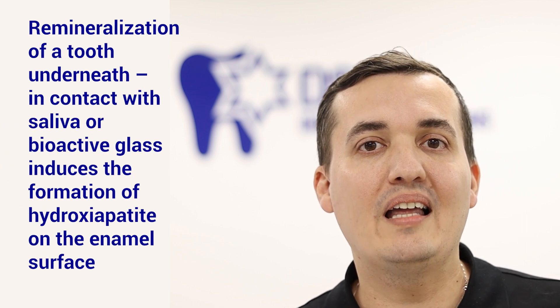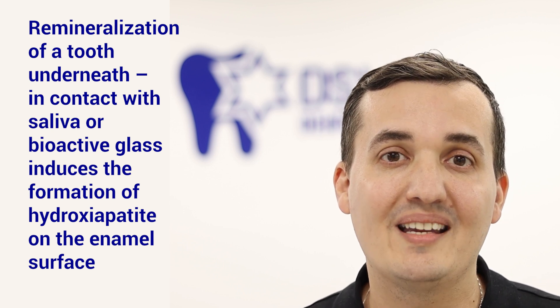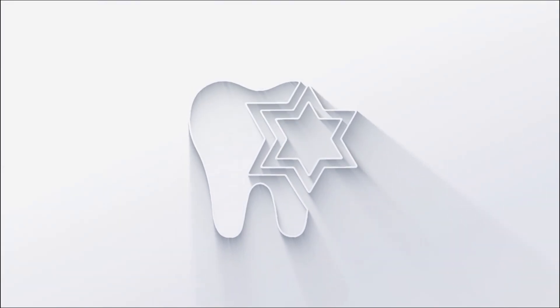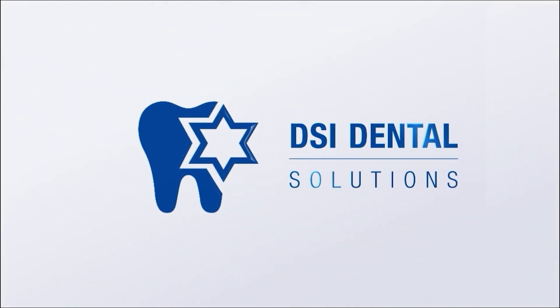EverBond delivers virtually no postoperative sensitivity and promotes remineralization of the tooth. When in contact with saliva, the bioactive glass induces the formation of hydroxyapatite on the enamel surface. We've incorporated all you actually need and want for your dental bonding in one material — DSI EverBond. Brought to you by DSI.